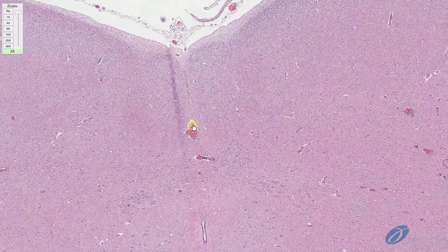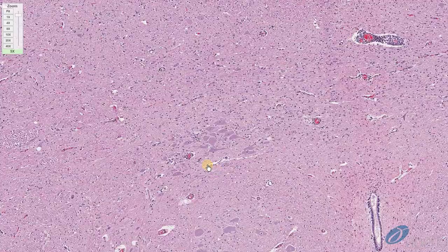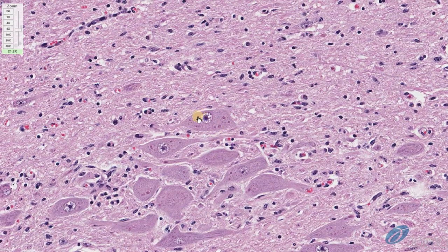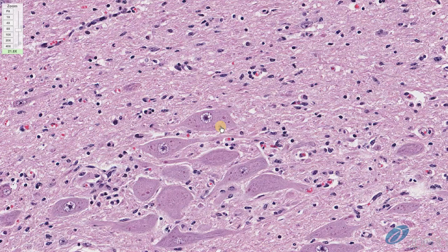Here are additional examples of perivascular cuffs. At higher magnification, we can see within the neurons several eosinophilic, 2-to-4 micron intracytoplasmic inclusion bodies. These are called nigri bodies — the virus factories we described earlier in the video.